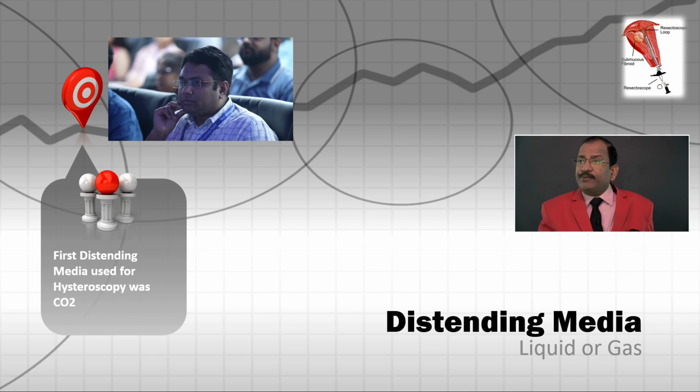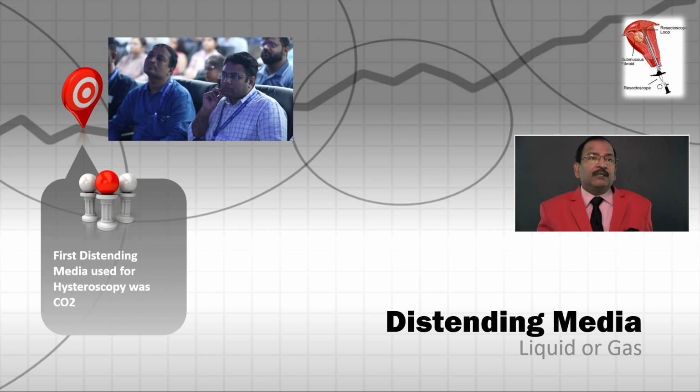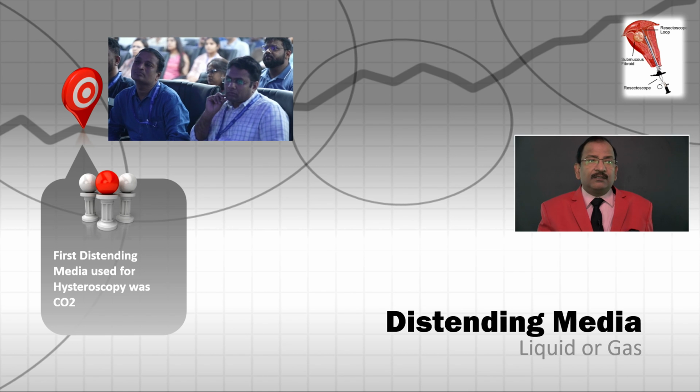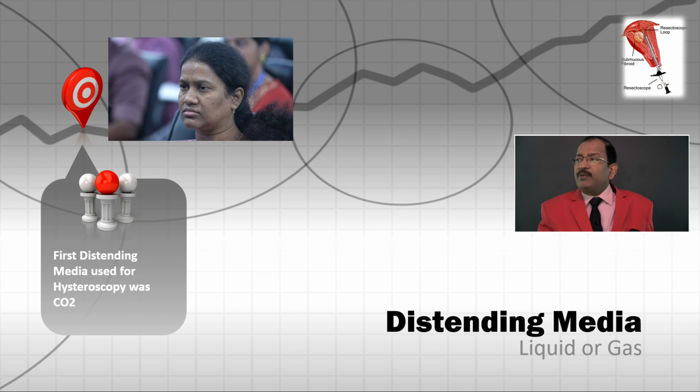Under fluid, the temperature can never increase beyond 100. This is the rule: as long as even one drop of fluid is present, the temperature cannot go beyond 100, because at 100 water evaporates. So there will be no burn. But here there will be a burn, and in this burn smoke will be produced.